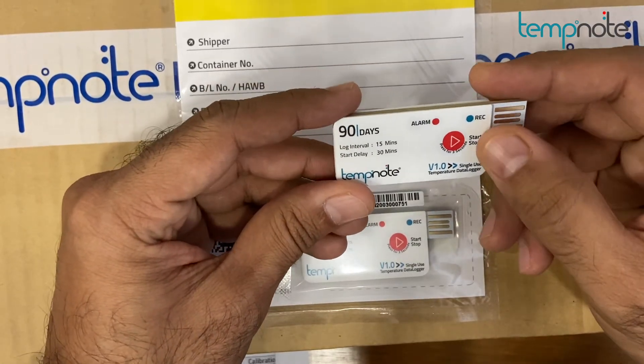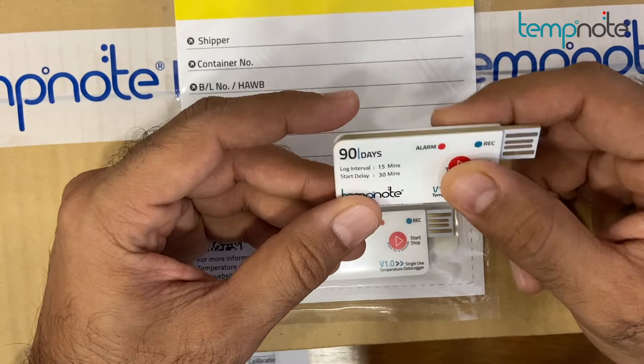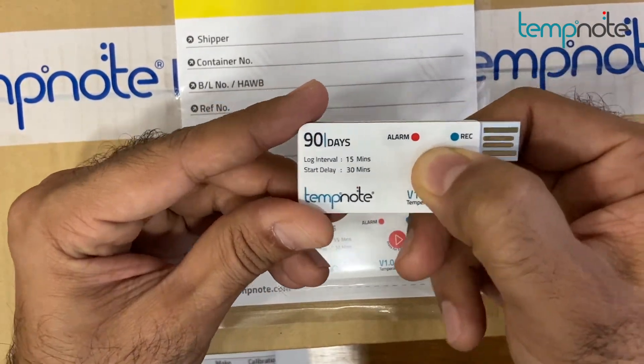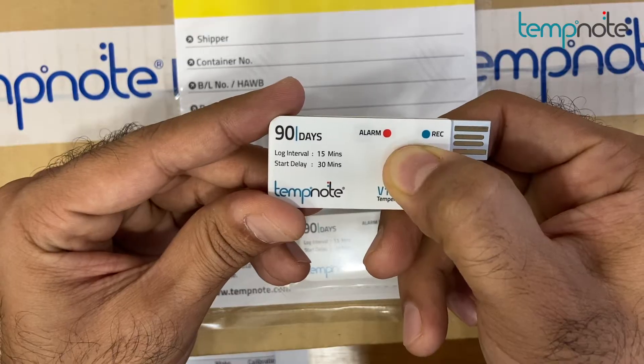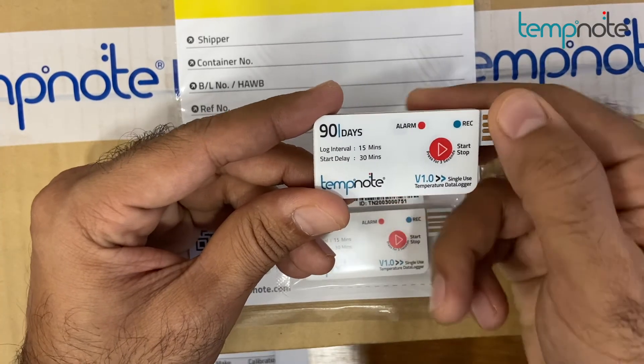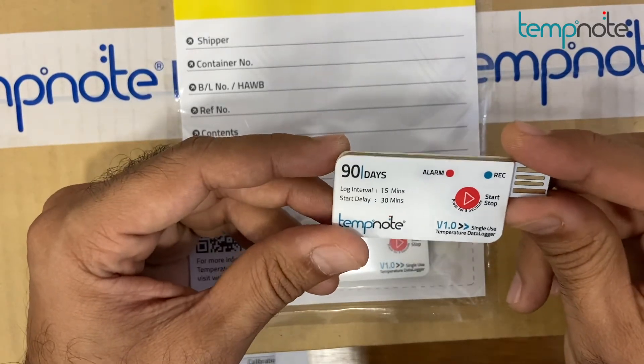To retrieve the data report from the device, recover the device from the cold chain box or reefer container. To stop the device, long press the stop button for at least 3 seconds. The red LED light on the device will illuminate for a long time, indicating successful stop of TempNote V1.